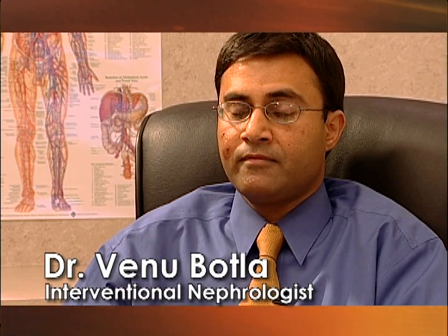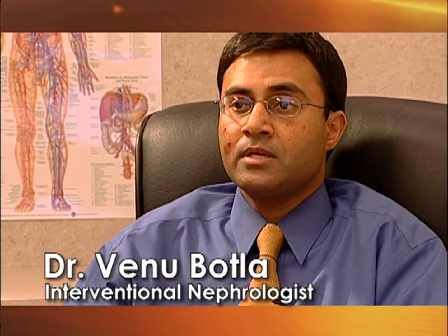My name is Dr. Botla, and I'm a kidney doctor here at the Vascular Access Center. The purpose of this video is to describe the vein mapping procedure. A vein mapping study is necessary before a dialysis access can be created by the surgeon. This is done in anticipation of a patient needing hemodialysis.